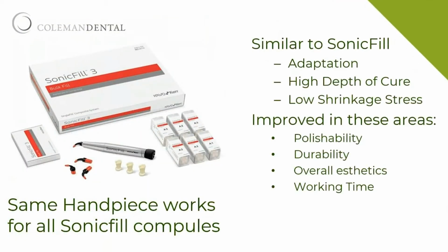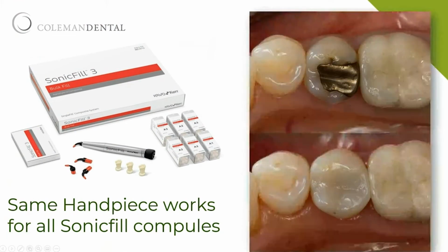This is where I'm at today with the SonicFill 3. Improved durability, polishability, working time, and overall aesthetics are great. You can see how the luster now on one that's been in, I think this one's probably 3.5 years, how well the luster has maintained in comparison to the original SonicFill.